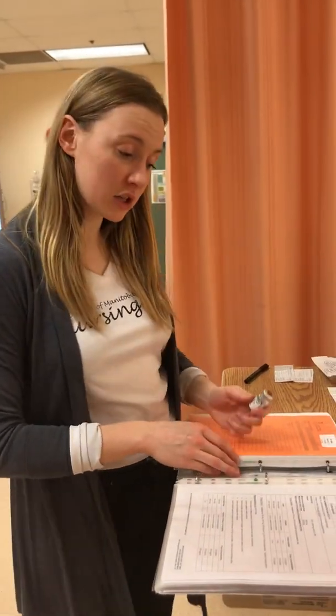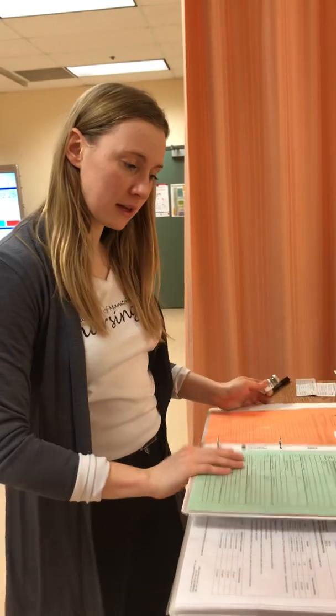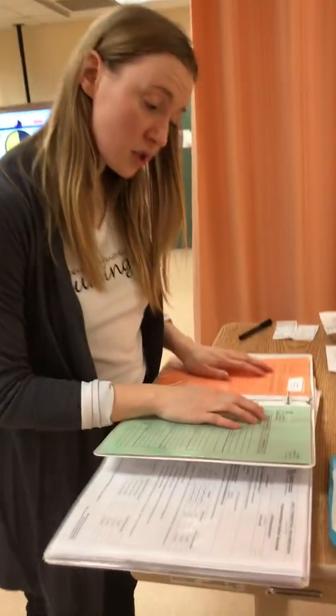My name is Leah O'Hara. I am a student nurse and I will be administering hydrocortisone to my patient via CIVA pump for this video demo. Okay, so the first thing I would do is compare the physician's orders to the MAR.